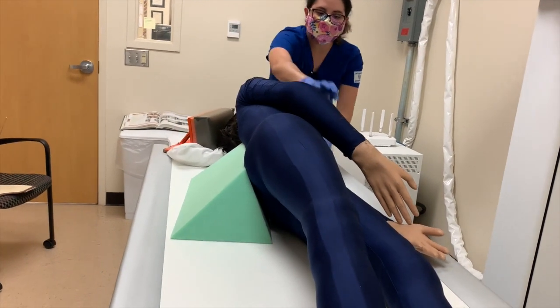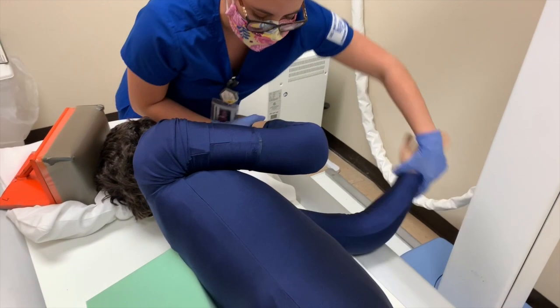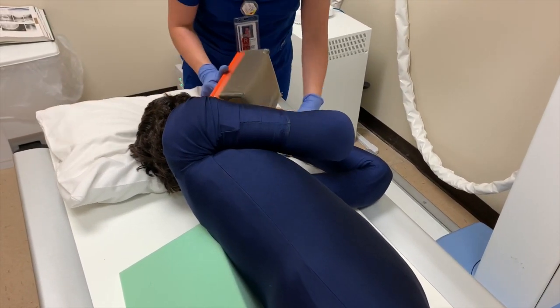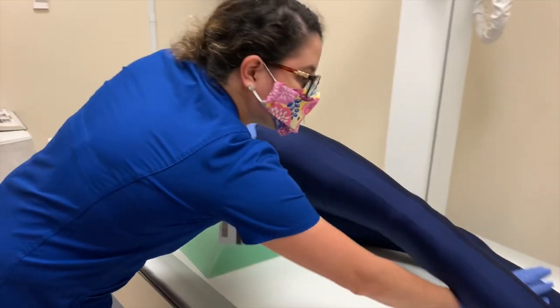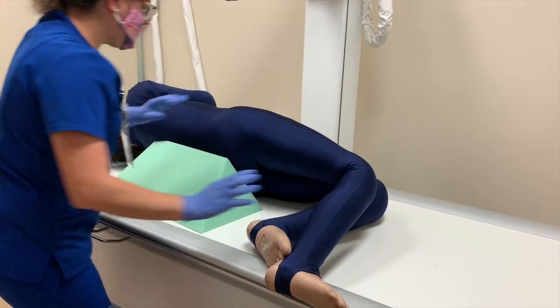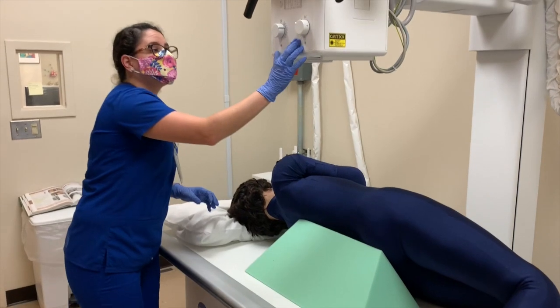I'm going to bring Molly's hands forward into a praying position, so where they're up near her head. And I'm going to use a weight to hold them in place. I'm going to flex her knees. Make sure the sponge is under there.